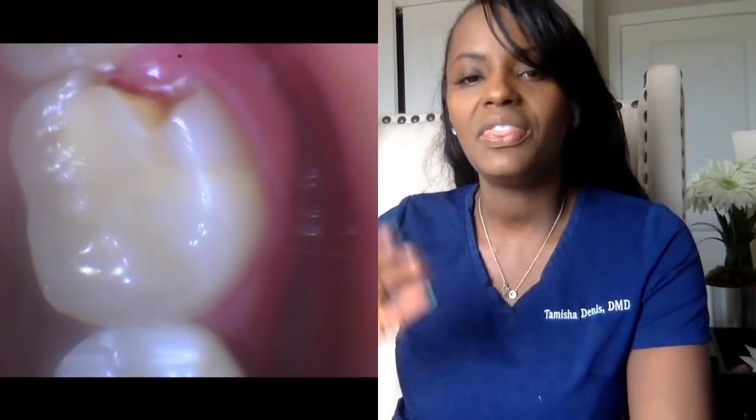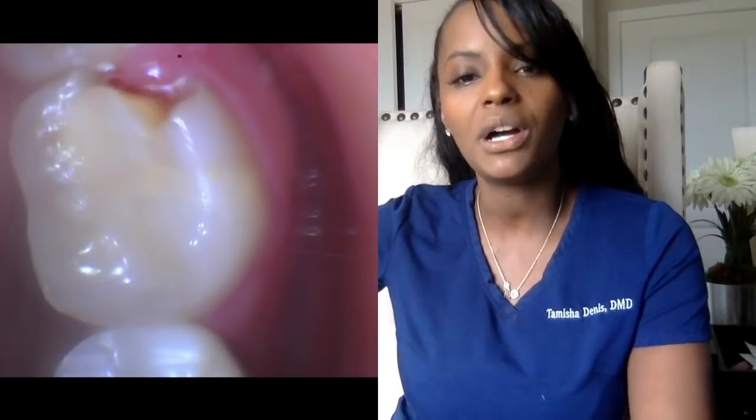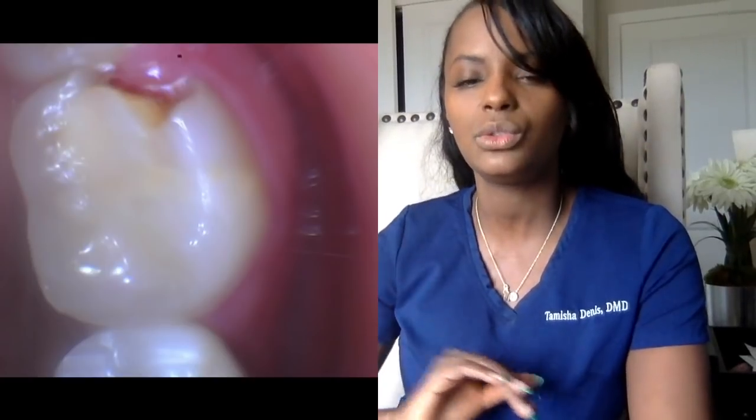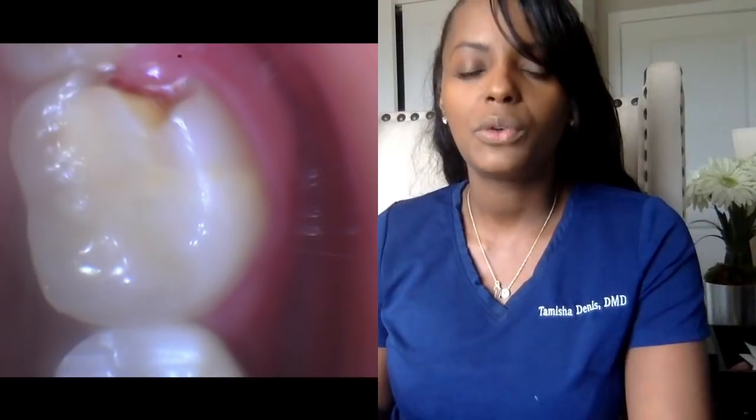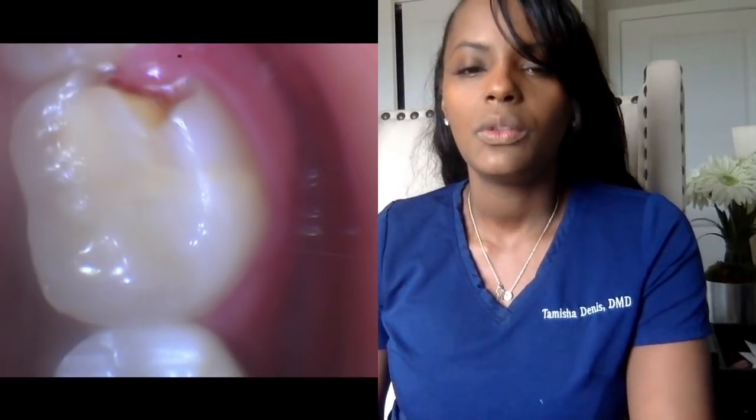I rarely get anybody who comes in and says, 'I was eating ice and my tooth broke,' even though that happens too. As you can see in this picture, we call it the distal buccal cusp — meaning the backside of the tooth and the part near his cheek — and that was broken. Already about three-fourths of the tooth was already filling, so we needed to do a crown.